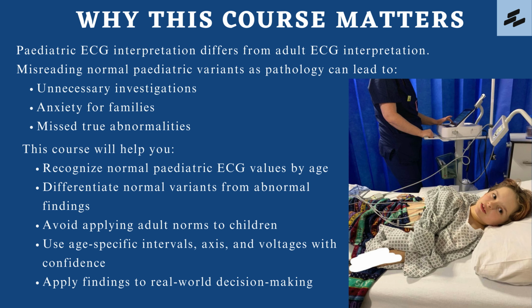Why this course matters. Pediatric ECG interpretation is not the same as adult ECG interpretation. The developing heart changes significantly from the neonatal period through adolescence, and these changes are reflected in the ECG. If adult norms are applied to children, normal pediatric variants may be misclassified as abnormal, resulting in unnecessary investigations, inappropriate referrals, and anxiety for families.